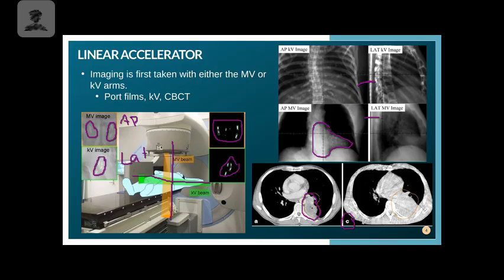But anyway, we're going to flip back and forth from this day that we just imaged back to their very first day from simulation, and we'll flip flop those images back and forth until we can align them so that they are almost perfectly overlapped.